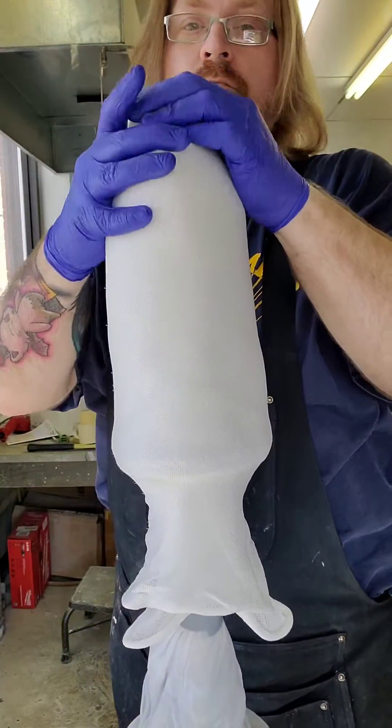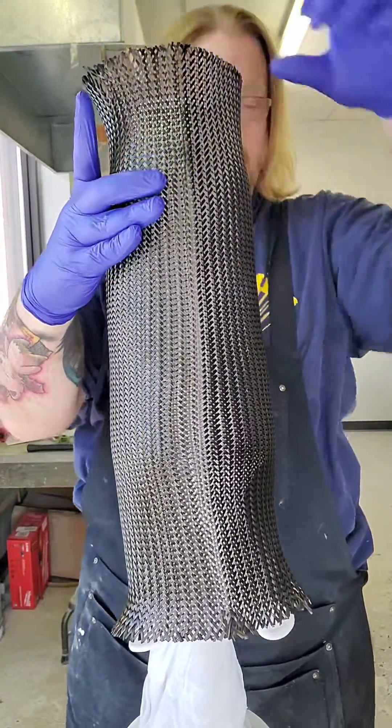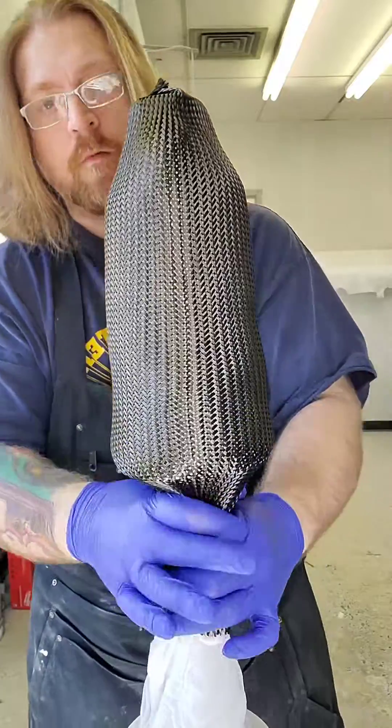After that initial layer of nyglass, I'll use a carbon fiber braid. I just use a little bit of spray adhesive to tack it in place. Not too much adhesive because I don't want to take the place of the resin — I just want it to stay in place for a moment.